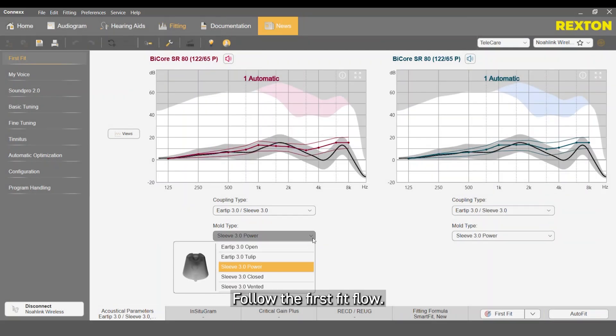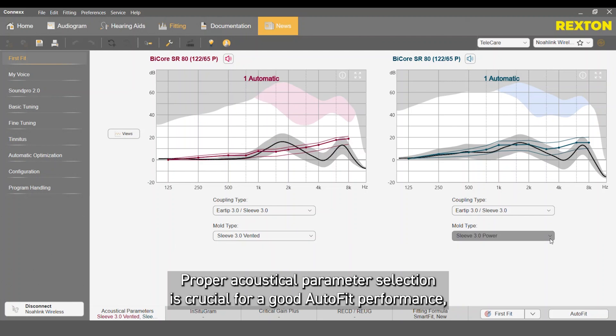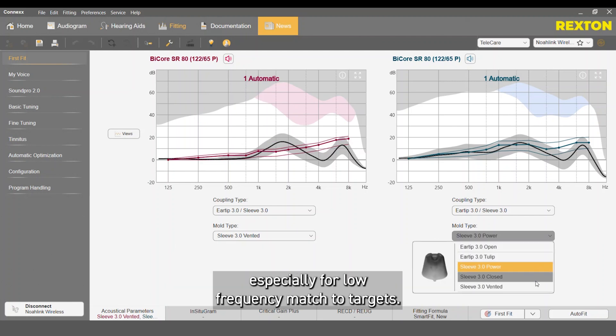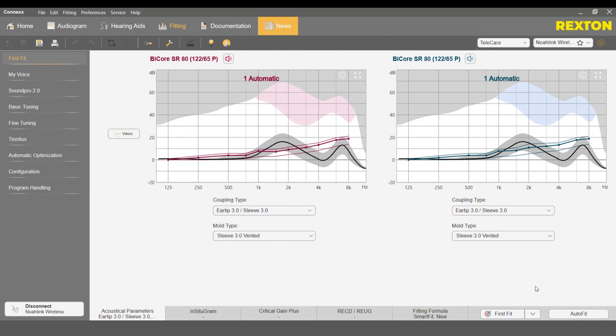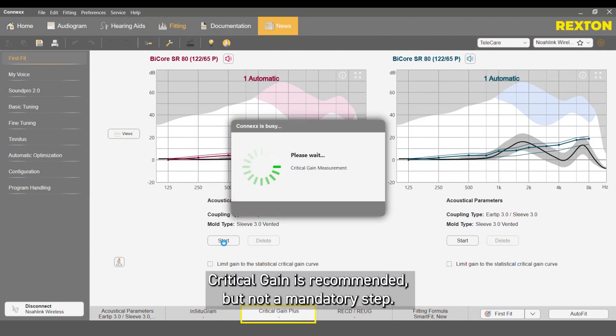Follow the FirstFit flow. Proper acoustical parameter selection is crucial for good AutoFit performance, especially for low-frequency match to targets. Critical gain is recommended but not a mandatory step.